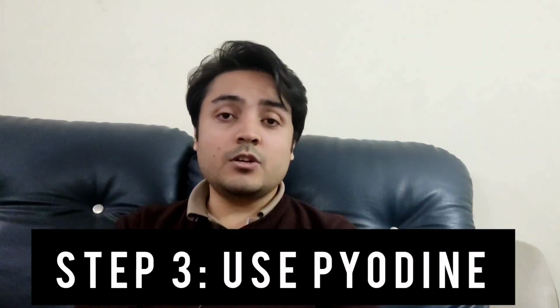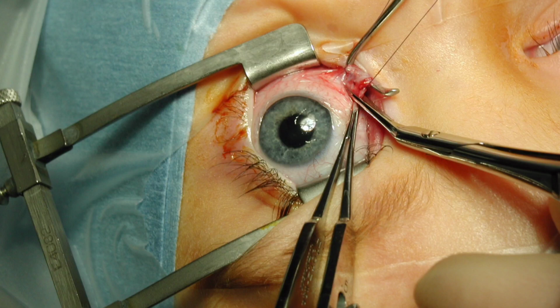Once the anesthesia is given, you pat the eye and let the anesthesia take effect, usually for 5 to 10 minutes. Then you shift the patient to the OT. Once the patient lies down, you first clean the eye with povidone-iodine. Then you cover the face, the rest of the parts that need not be operated, and leave just the eye open, and you place 2 clamps to keep the eye open. At this time the patient is awake but his eye is anesthetized, and you have to tell the patient to follow your commands. If you tell the patient to look down, he will look down, or look up. So in this procedure you have to actually talk to the patient so he listens to your orders and make sure he doesn't get up or make sudden quick movements.